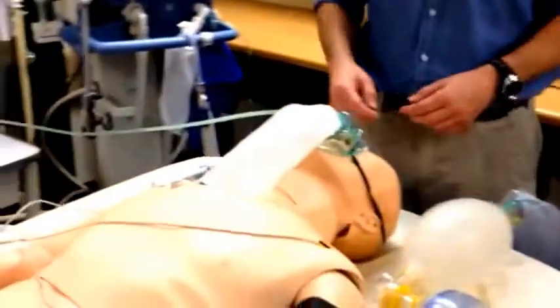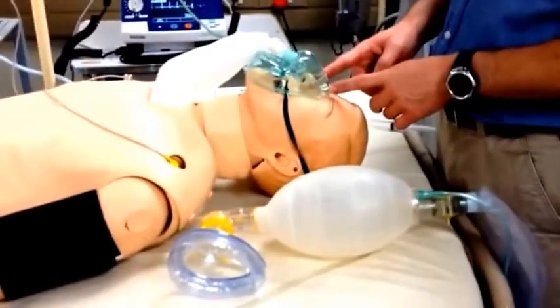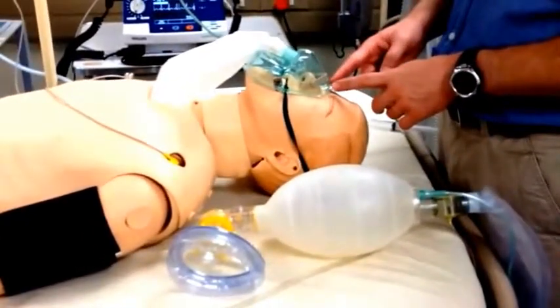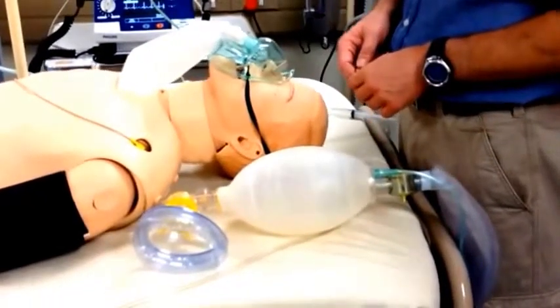The first thing, after your equipment has been checked and your bedside equipment is checked and connected to the patient, would be to pre-oxygenate the patient. To pre-oxygenate a spontaneously breathing patient, simply connect them to a high-flow oxygen mask, such as this non-rebreathing mask and wall oxygen, and make sure that they are breathing high concentration oxygen for 3 to 5 minutes.